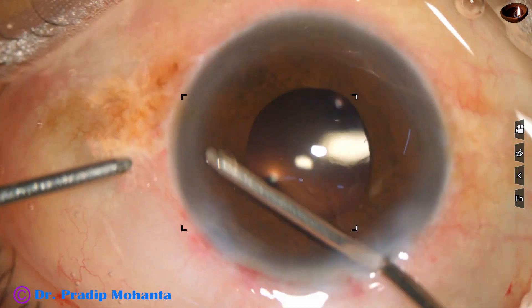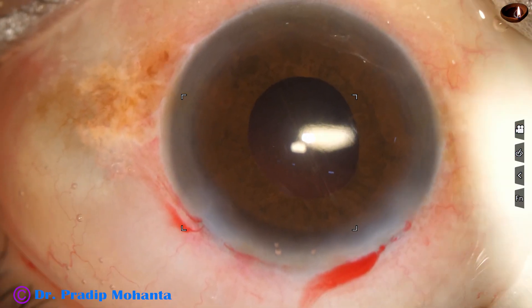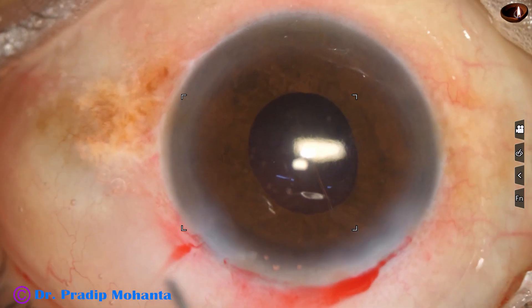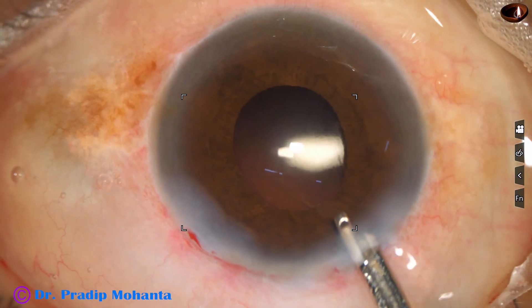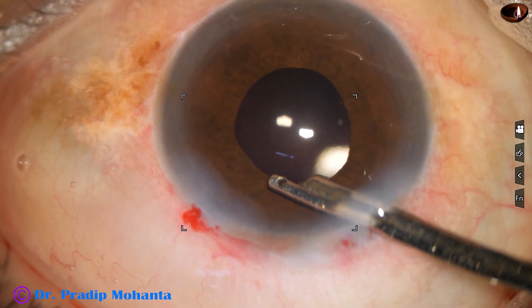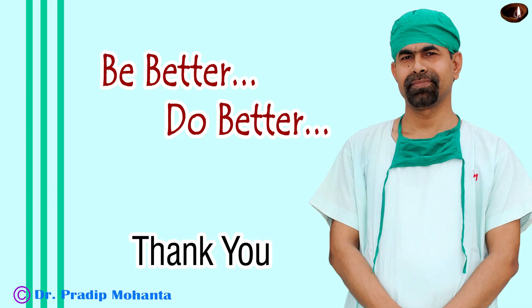And now I use the irrigating probe of bimanual IA. This is moxifloxacin — a bit of moxifloxacin. The side port is closed by hydrating corneal stroma. Now is the final lavage of the anterior chamber. This is a real-time surgery, totally unedited and you haven't missed anything. The anterior chamber is nicely formed. Integrity of all the wounds are checked. Few drops of moxifloxacin applied over the cornea and the case is concluded. Thank you very much for your attention. Hope this video will help you in developing your surgical skills.